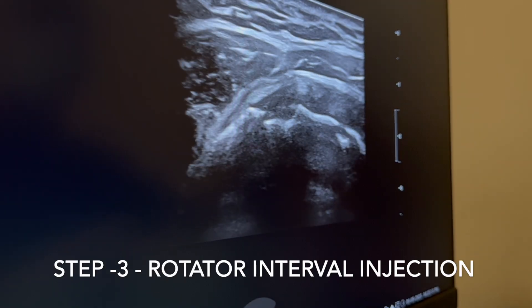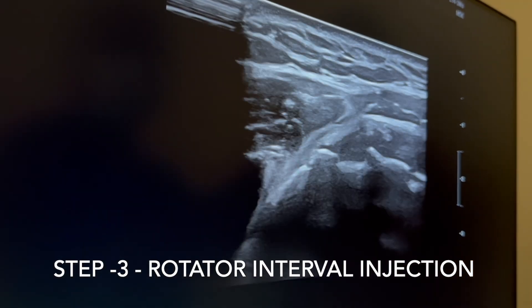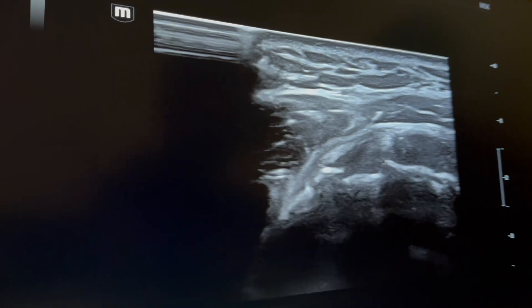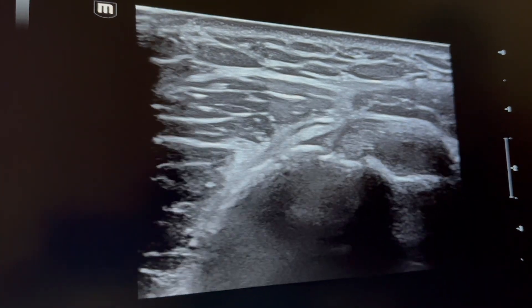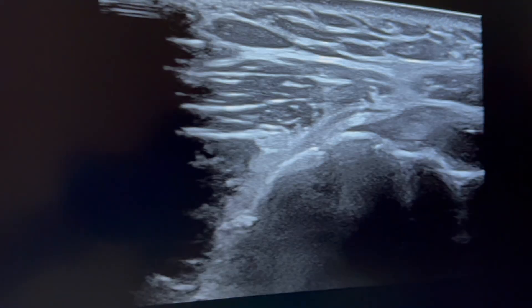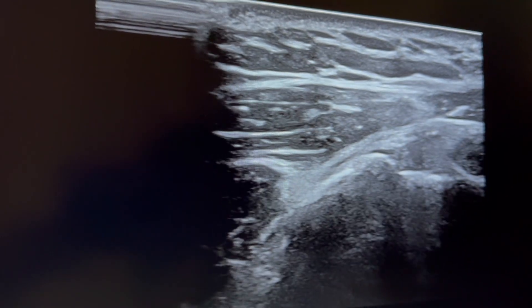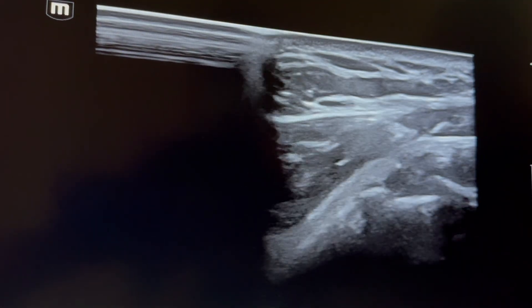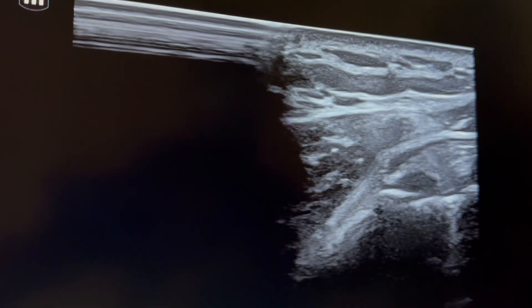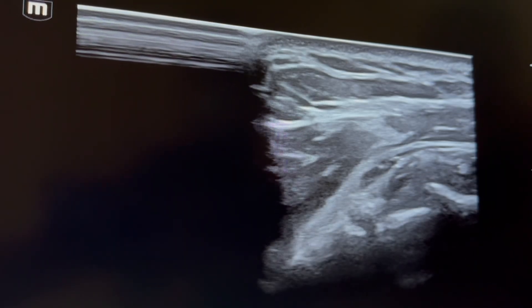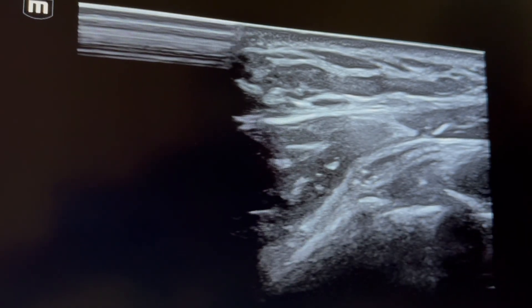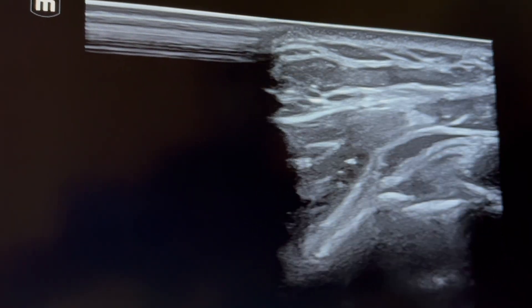The third step: with the patient seated, in the axial view, a small 2.5 cm needle is placed into the rotator interval. The tip of the needle is confirmed in the rotator interval, then approximately 4–5 ml of the triamcinolone-lignocaine mixture is injected here, because the rotator interval is the primary pathology of adhesive capsulitis.